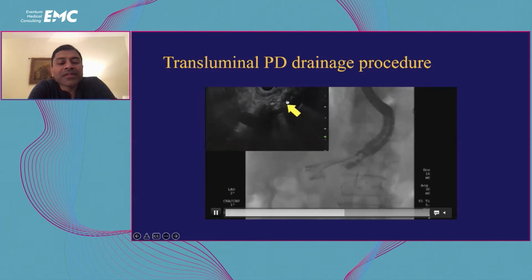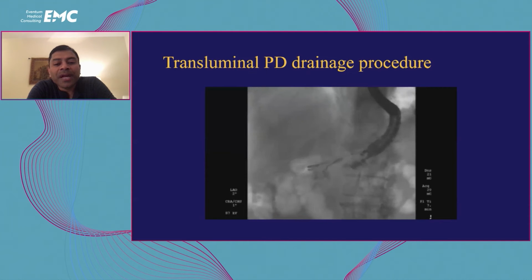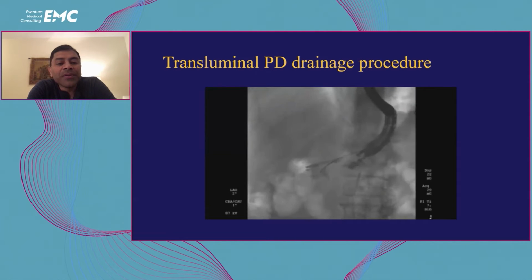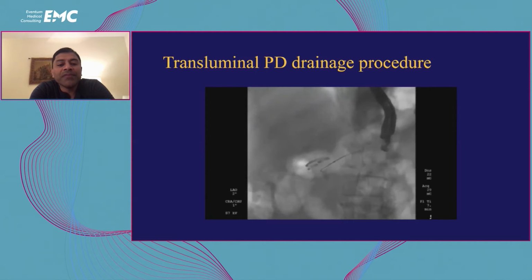It's important, once again, to stay as close as possible to the stomach. It is also important that the procedure is completely performed under EUS and fluoroscopic guidance and not endoscopic guidance. If you want to achieve endoscopic view, then this procedure will become a failure. Very often you move away from the pancreatic duct, you lose access, and performing the procedure becomes difficult. So this is a semi-blind procedure where it's performed only with EUS.